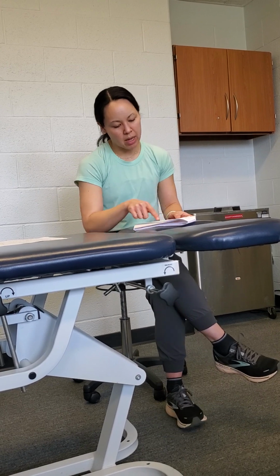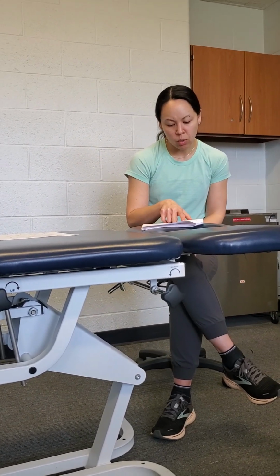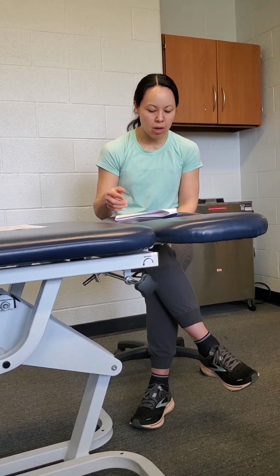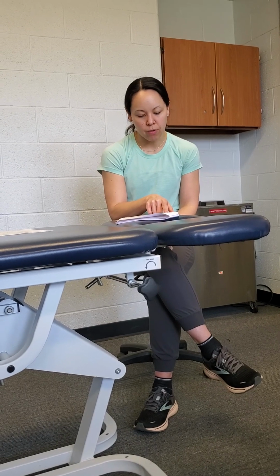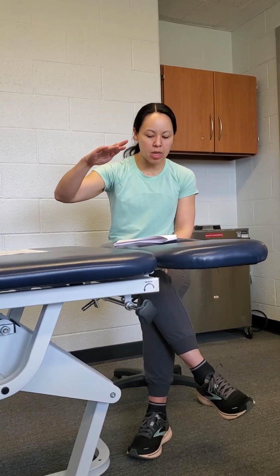For blood pressure, this article by Severin in 2020 basically takes you through the algorithm here. I wrote it out. I won't read that to you either, but I'll go over the first one. Systolic blood pressure less than or equal to 139 and/or diastolic blood pressure less than 89: you'd want to document in the chart and inform the patient, but it's okay to do BFR. Does that make sense? If they're below 139 over below 89, document it in the chart, inform the patient, and it's still safe to do BFR.